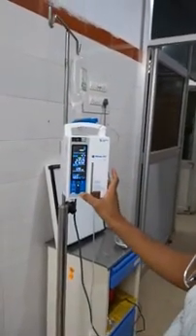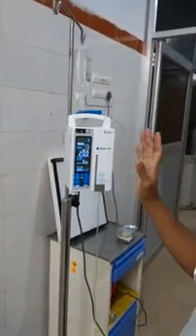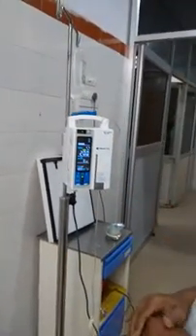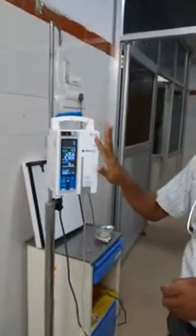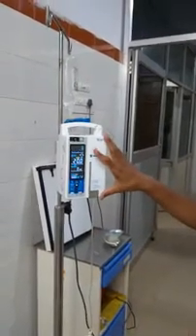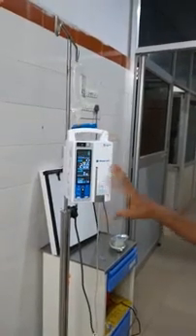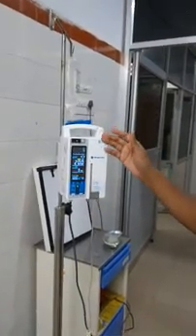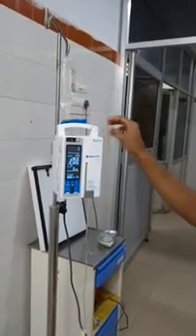So now we see that it is infusing and the air in line problem is solved. Another important thing is that the tubing which we are putting inside has to be changed every 12 hours. The segment which passes through this can be changed, because the peristaltic fingers leave an impression over the tubing.